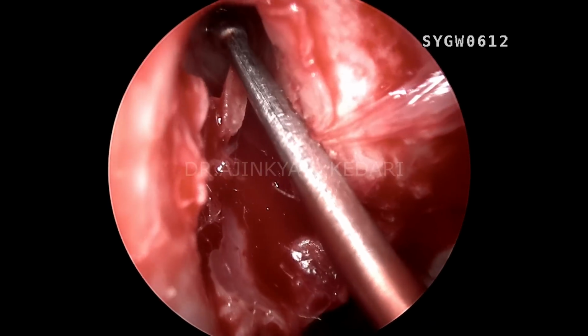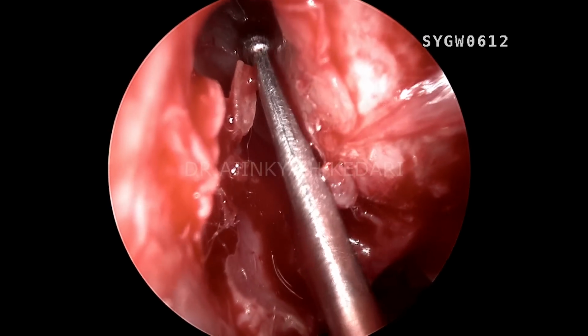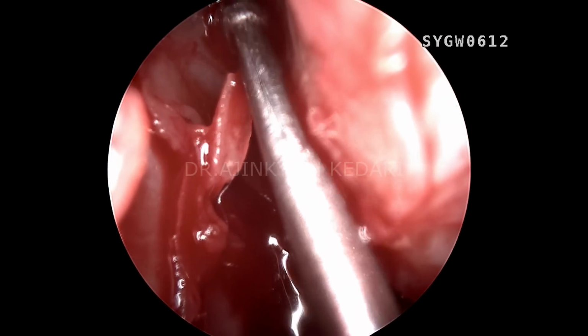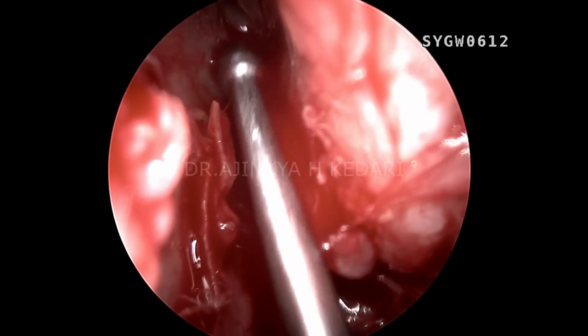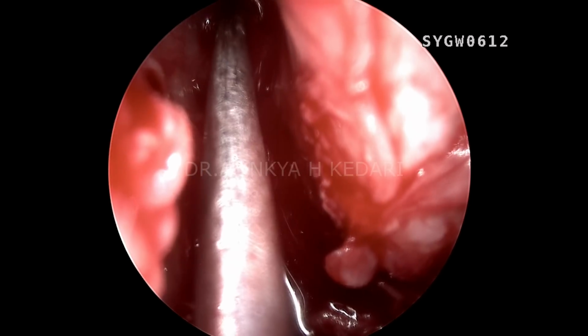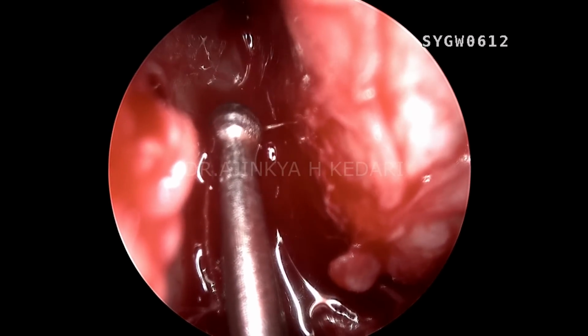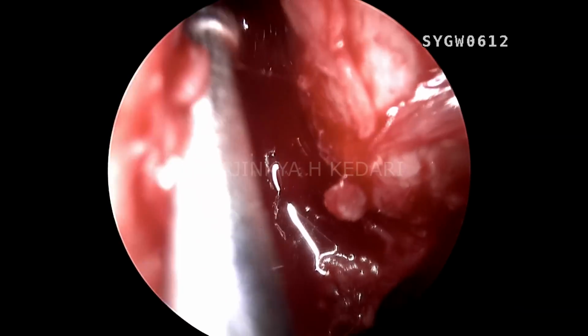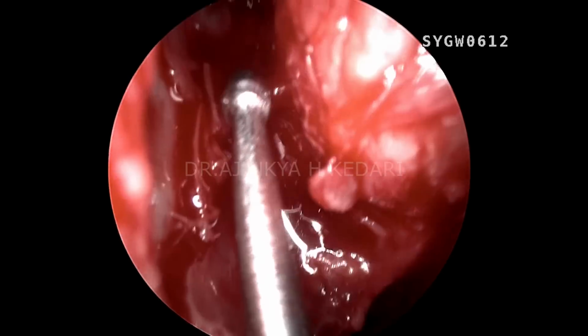So I'm going to take a ball probe. This is still a 0 degree, and you can see I'm going to go inside and feel for the giveaway of the resistance, making me sure that the defect is present. You can see my ball probe has gone through and through the skull base. That's the ball probe going through and through the skull base. That is the defect there.